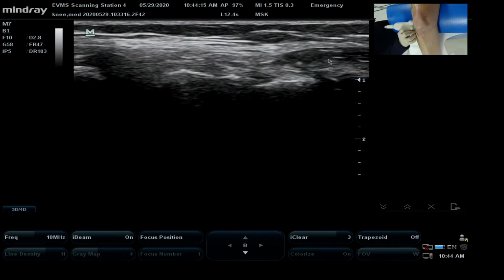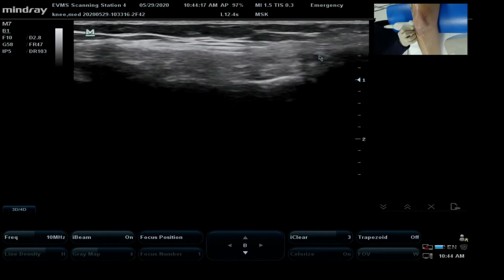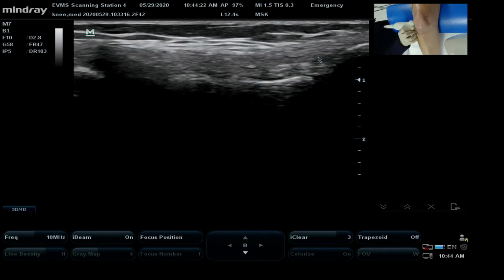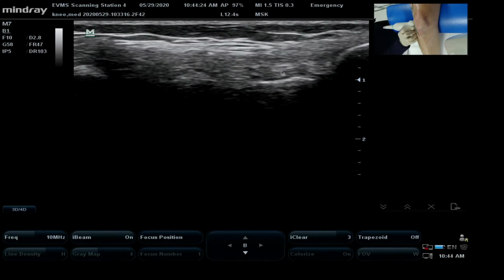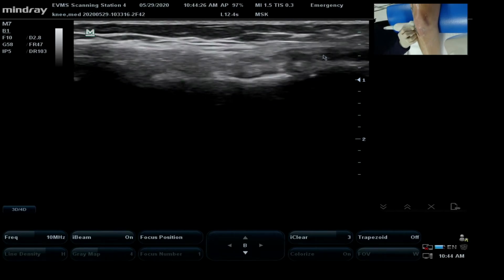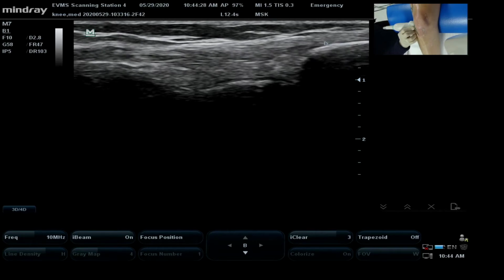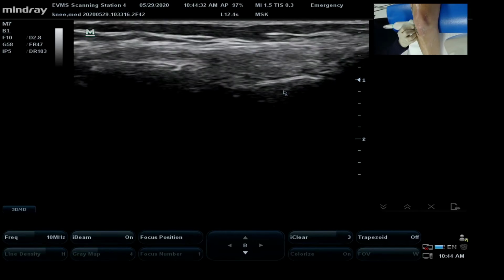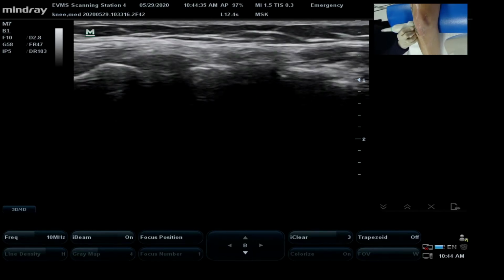Now let's see if we can go ahead on down towards the distal again, and on her, here is the biceps femoris here, and I actually have to make a few little adjustments to get off of it and be able to get back into the tendon. And then here's the tendon riding up over the top. Here's again her biceps femoris here. So just be aware of the anatomy that's going to be in the area.